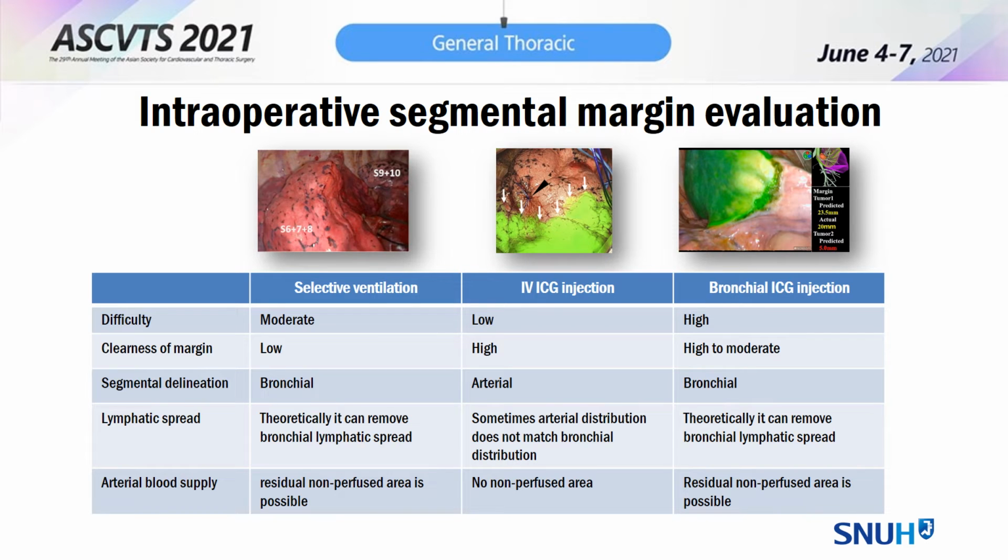And what is my practice? My preference is using the IV ICG injection because it is simple and a direct way to identify the segmental plane. But we need some papers showing which one is better and which one is worse in the real practice of segmentectomy.